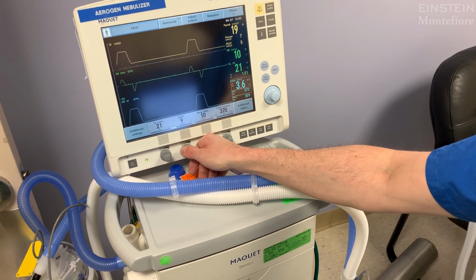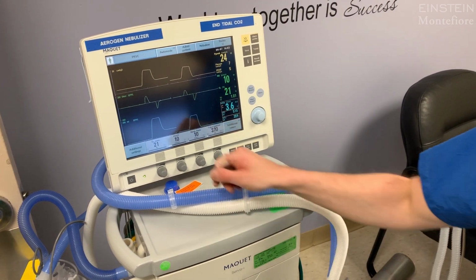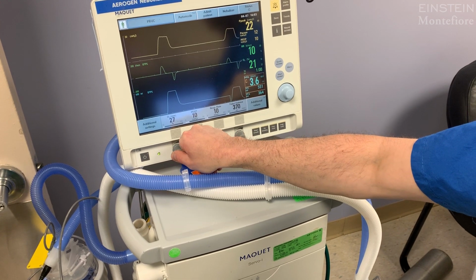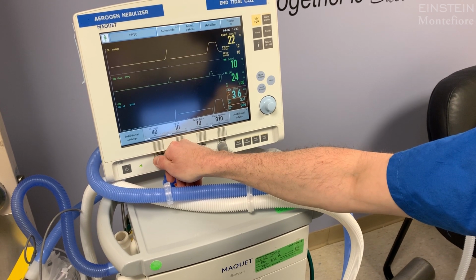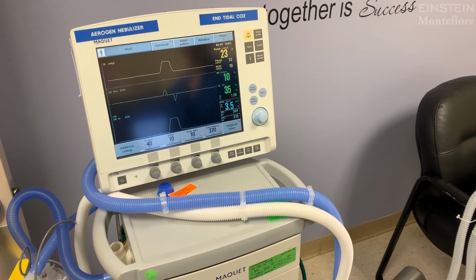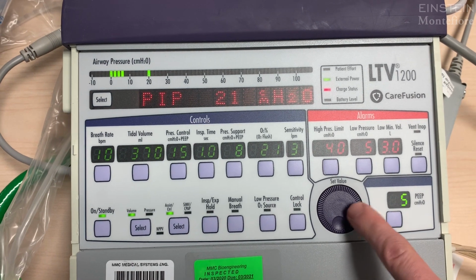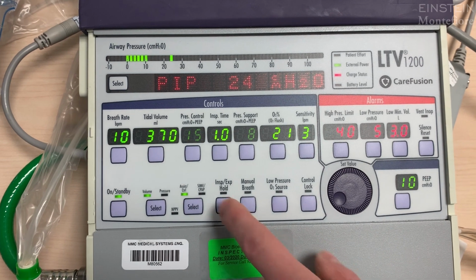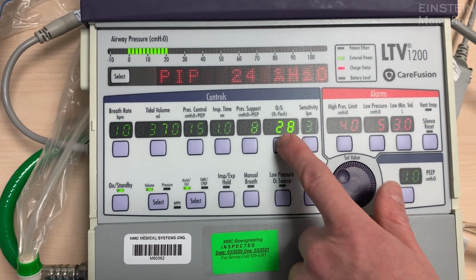So if you want to increase the PEEP to 10, you just turn it to 10 and the PEEP is at 10. To increase the FiO2, you do the same motion, you turn the knob until you achieve the fractional concentration of oxygen that you desire. On the LTV ventilator, to increase the PEEP, you go to the bottom right here where it says PEEP, you press, you toggle, and then you press again. Similarly, to increase the FiO2, you press, toggle, and then press again.